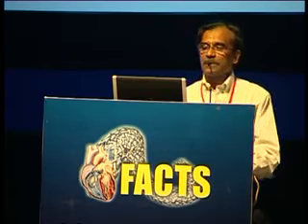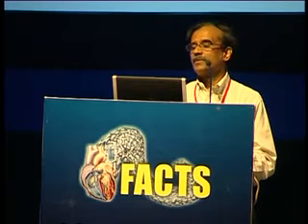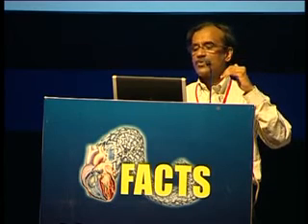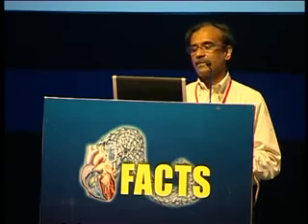The most important is direct crossing: once you position the balloon catheter deeper, you give a counterclockwise twist to the stylet so that it points anteriorly, and once you reach the mitral valve orifice, the catheter tip moves up and down like a woodpecker motion, and when in diastole it moves downward, then simultaneously withdraw the stylet and advance the catheter. This is the commonest way of entering the LV or crossing the mitral valve.